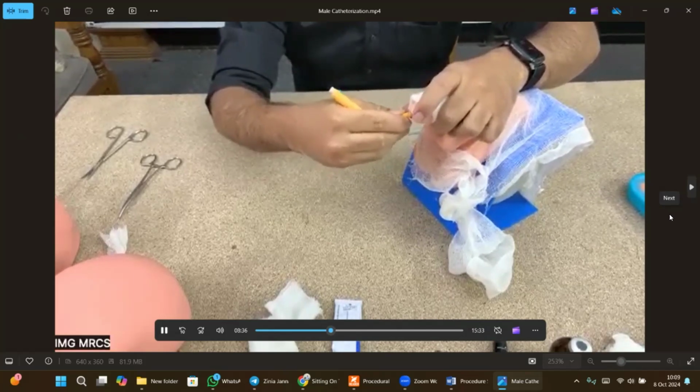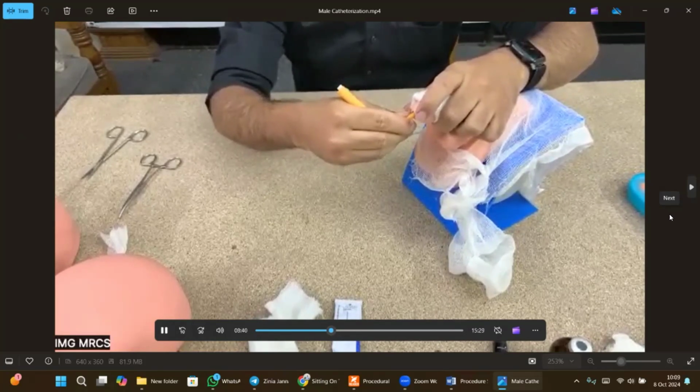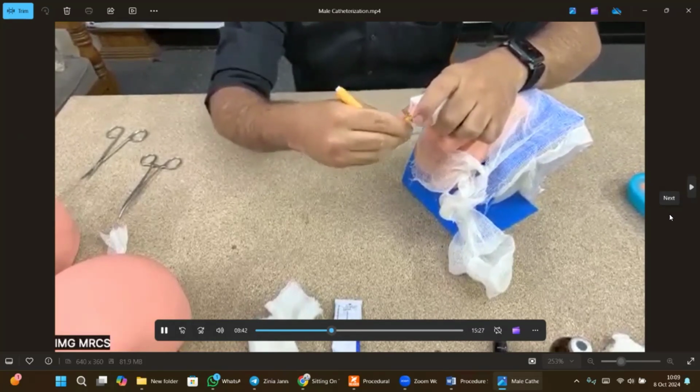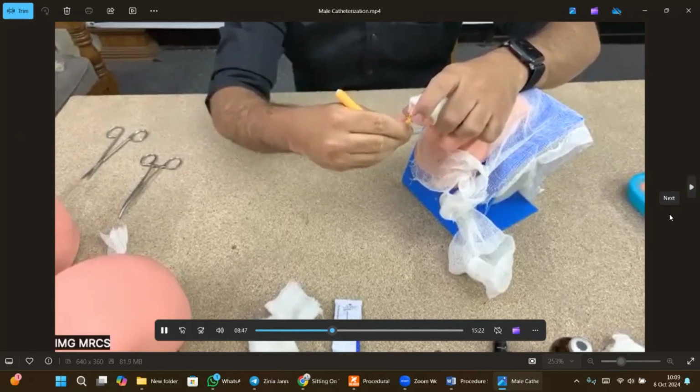Can anyone tell me what you are going to say to the patient? I'll say just wait for a few minutes, after that you can have water. That's the fault everyone will make. Don't do that. Ask the examiner that the patient can be given IV fluid, and the patient be given the water.